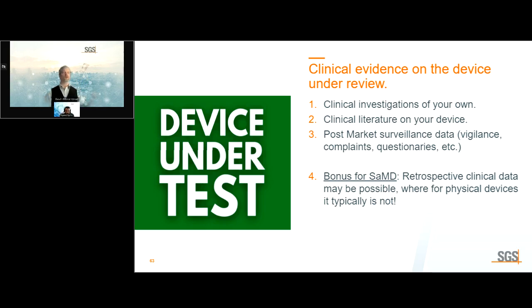SaMD has a very special route that almost no other device has, and that's retrospective clinical data. What does that mean? If you have software whose purpose is to analyze something, ECGs, EKGs, EEGs, or whatever, stroke volume variations, slew of other data, and it makes a diagnosis or prognosis from it.